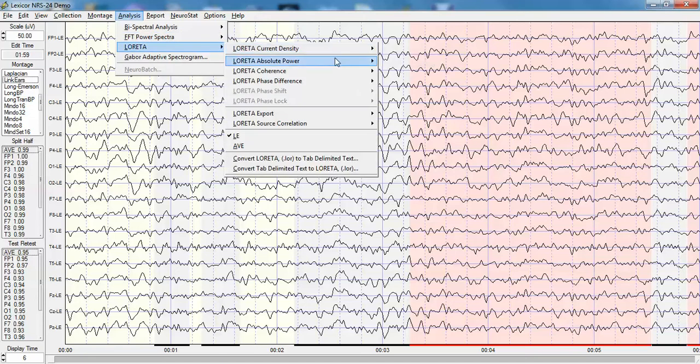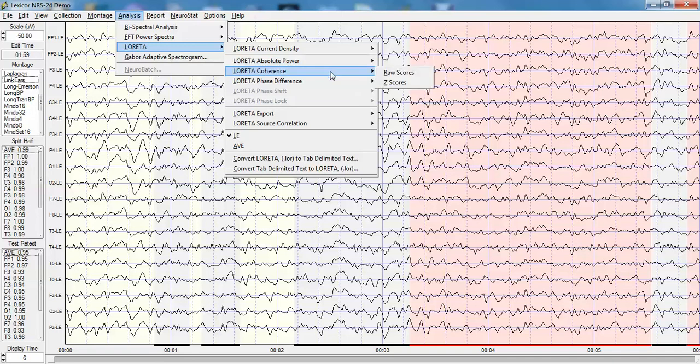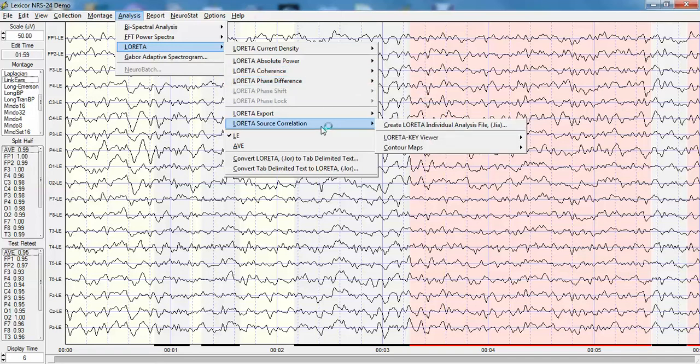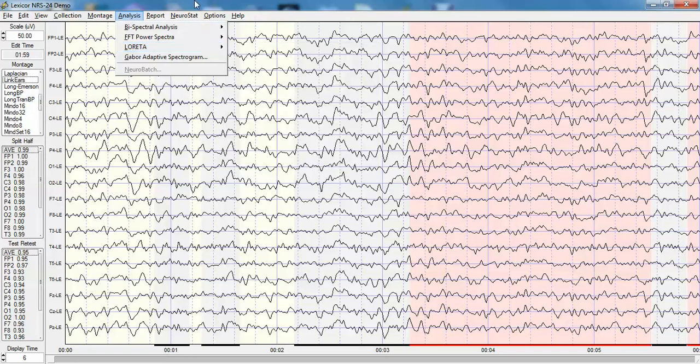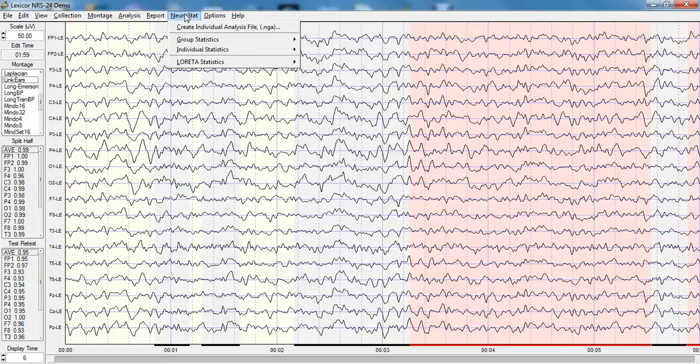These include raw scores, Z scores, current density, absolute power, coherence, Loretta coherence, Loretta phase, and Loretta source correlations, as well as converting the Loretta data that is generated as occurrence inside different 2,394 brain matter voxels into a form that can be easily analyzed using Systat and other statistical programs.